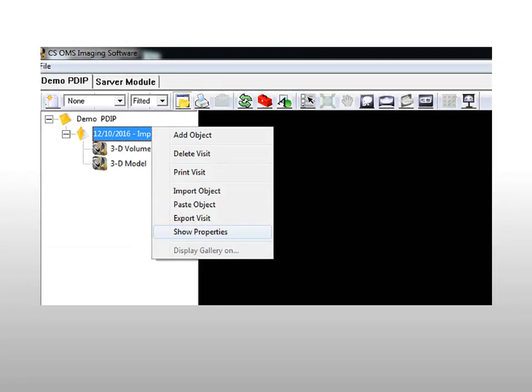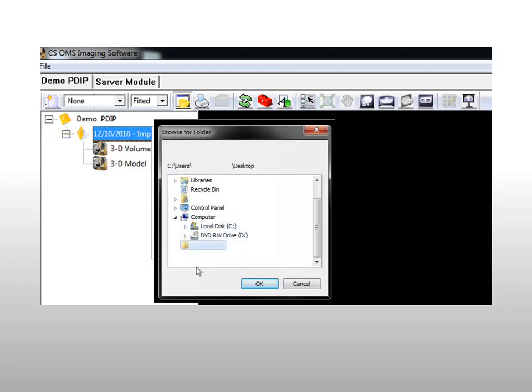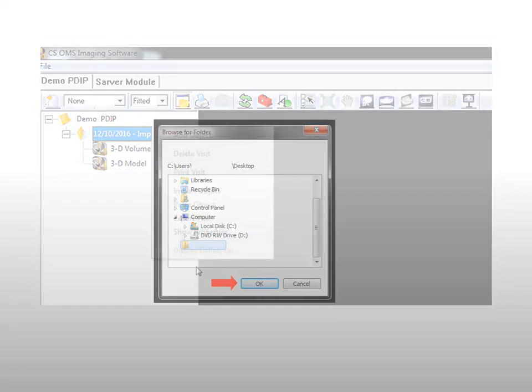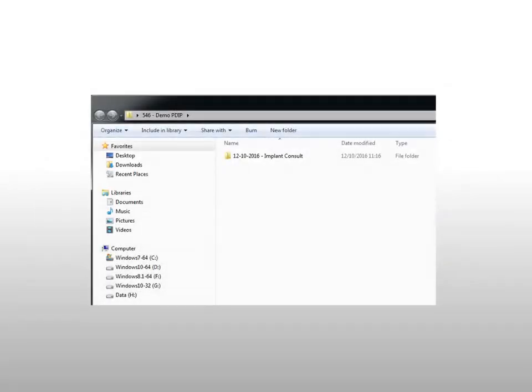To export data from CS OMS Imaging, select the patient visit containing the 3D model and 3D volume. Right-click on the visit and select the Export option. Select the location to save the export folder and click OK. The data set is exported.